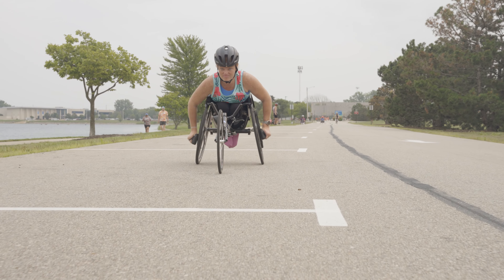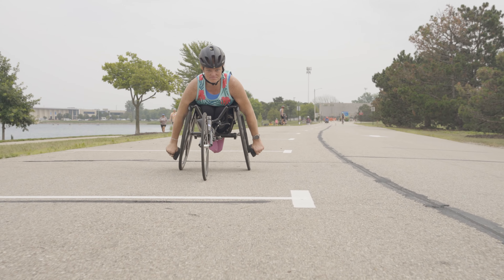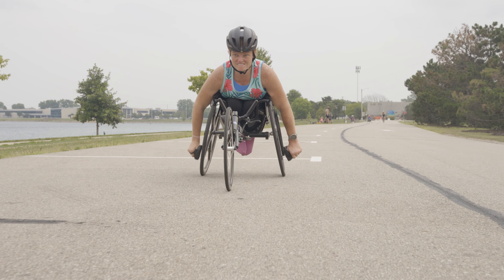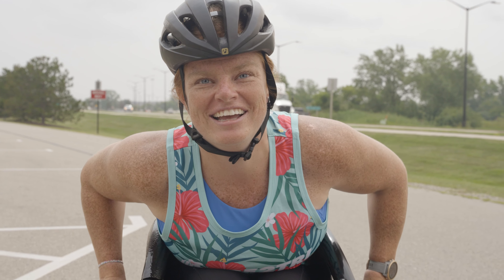Remember, mastering these racing wheelchair techniques takes practice and dedication. Experiment with different approaches to find what works best for you. With time and persistence, you can improve your performance and enjoy the thrill of racing on wheels. Happy racing!